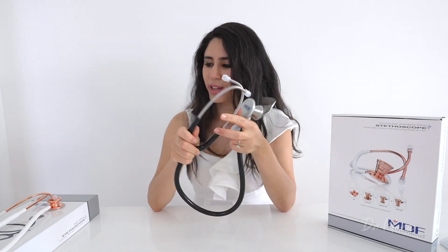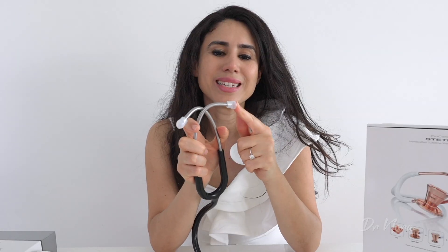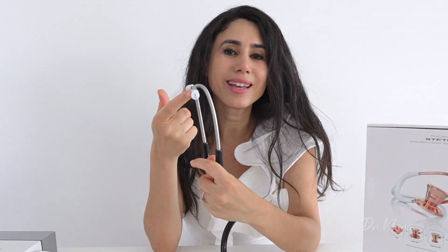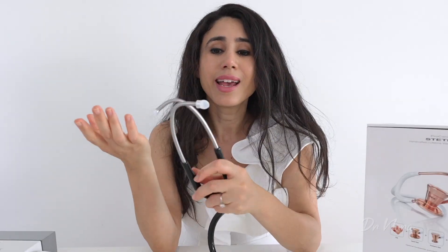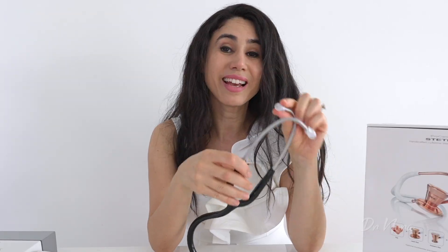It feels a lot sturdier than the MD1. The earpieces are clear, which is really important for hygiene purposes. With Littmann they have great ear tips, but I once forgot my stethoscope on a ward round, picked up my colleague's, and found it was just filled with earwax — so the fact that these are clear means you can check they're hygienic before use. I really like the clear tips.